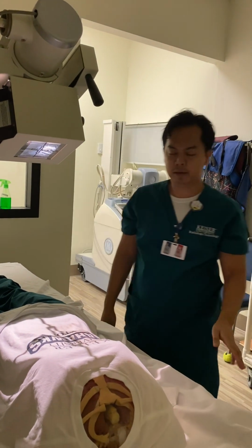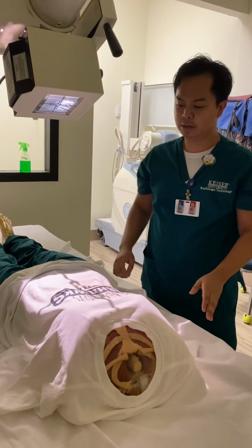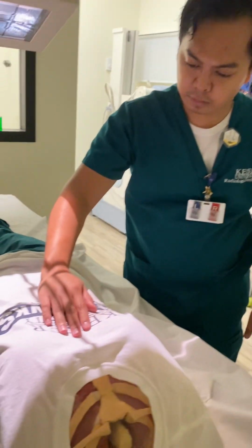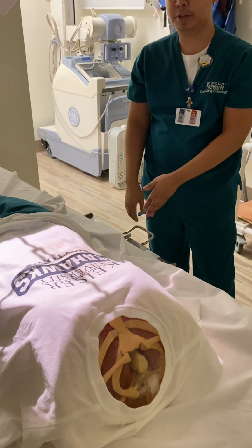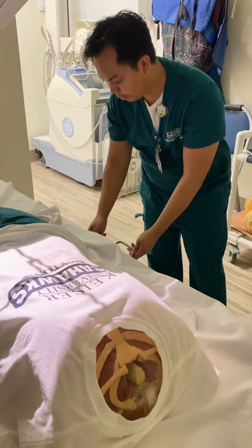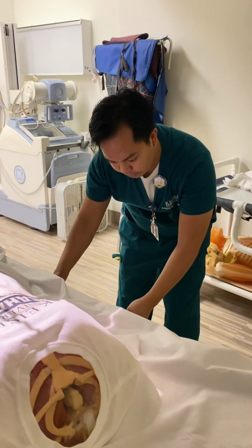So we'll have that, and the next thing we'll do is centering. Oh, before that, I'll have to align this again. Since I moved the tube, I'll have to align it to the digital IR. Make sure it's back to the light again.